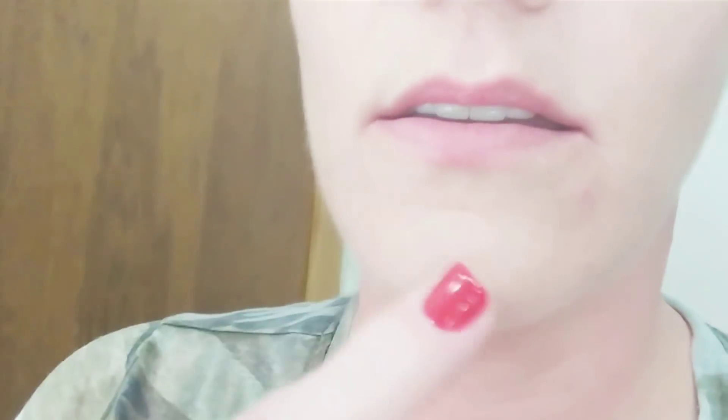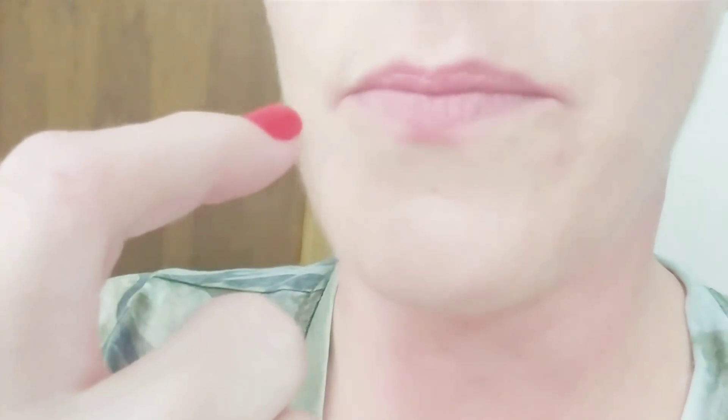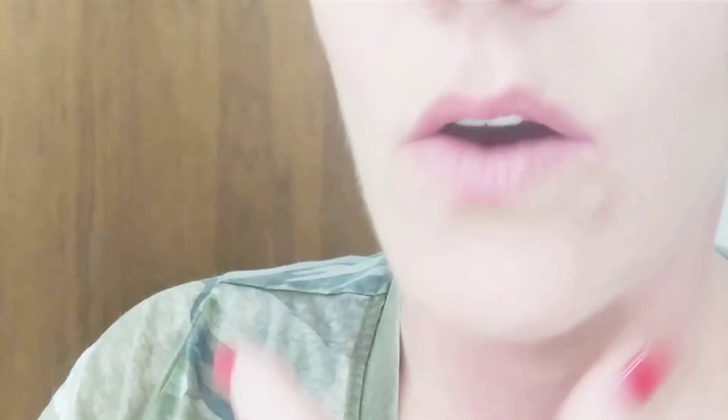My old upper denture before I bought the Russell Klein was the same way — the teeth were so worn down that the front teeth were half the size. Naturally my front teeth are very long. When I got the teeth from Russell Klein I couldn't get used to them at first — I thought they were too long and that I looked like a bunny. But it wasn't the denture, it was me, because after wearing a cheap denture for so long your face and gums adjust to how long the teeth are.